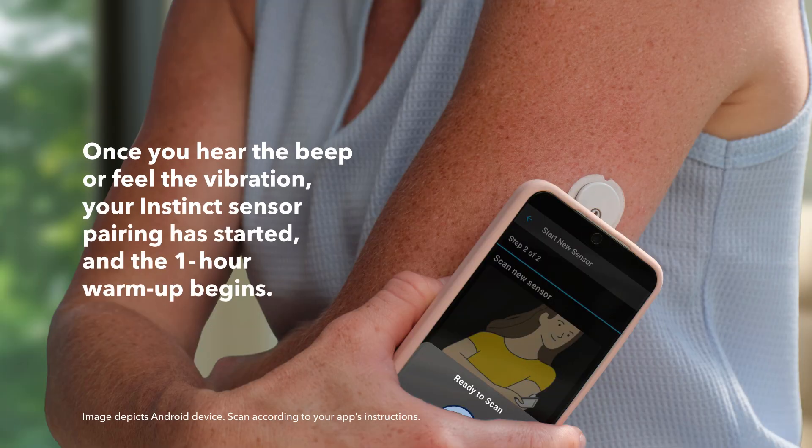Once you hear the beep or feel the vibration, this confirms that the sensor has been started and begins the warm-up period.